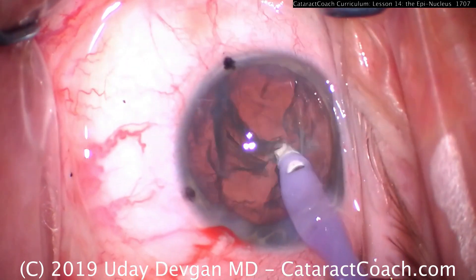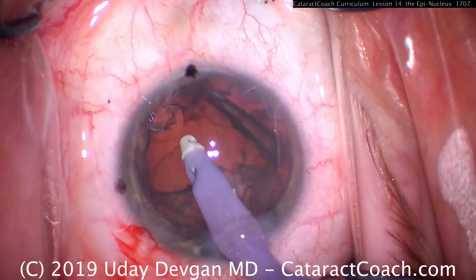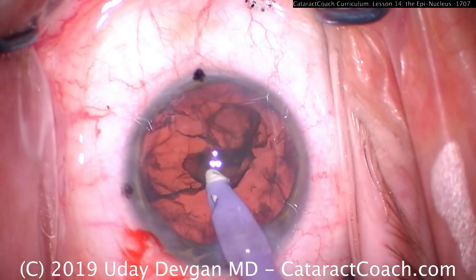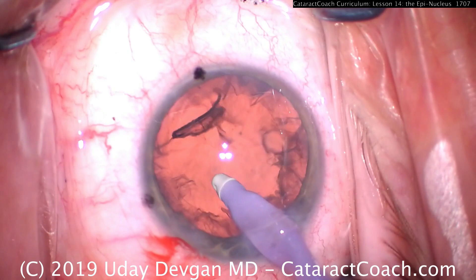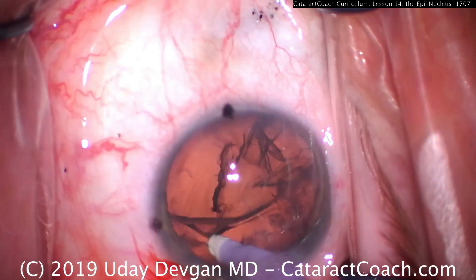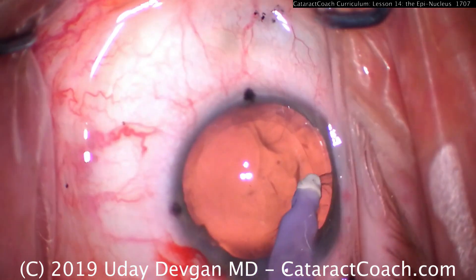The technique here is to go around 360 degrees and loosen up the attachment of the capsular bag from the epinuclear shell. Then we can bring the shell up and use very high vacuum — at least 500 millimeters of mercury — to just wolf it down and aspirate it. If need be, you can also use the spatula, the chopper, or any other second instrument to push pieces into the aspiration port to facilitate the continuous removal of the epinuclear shell.